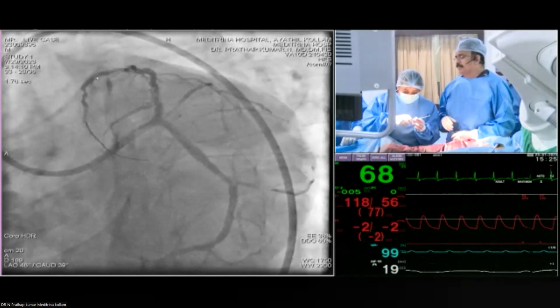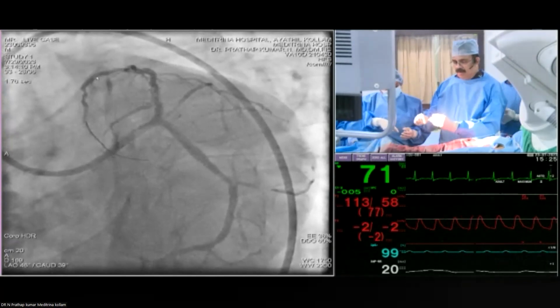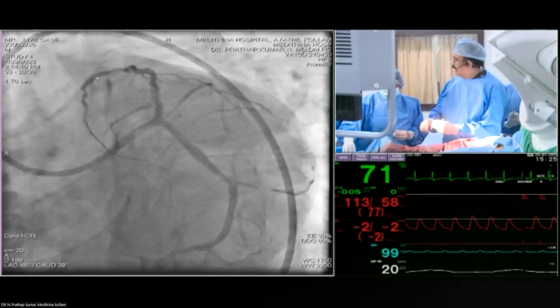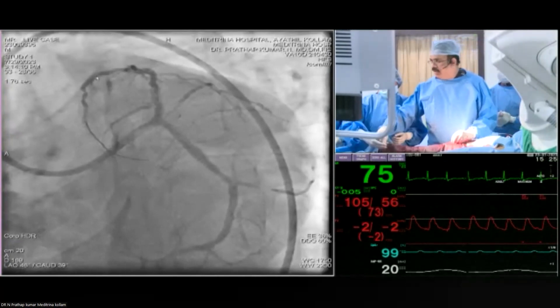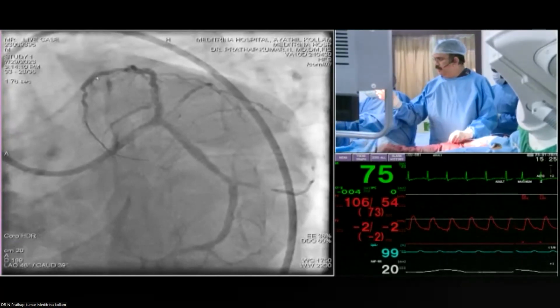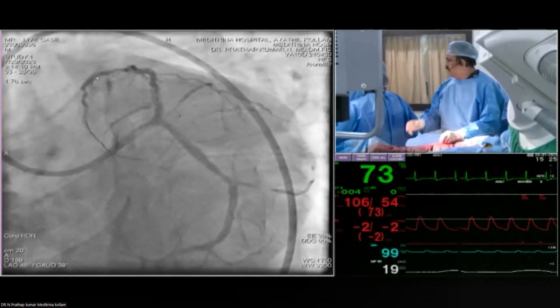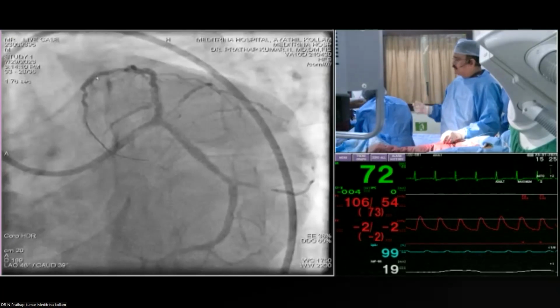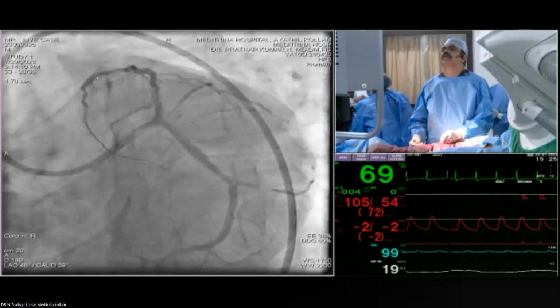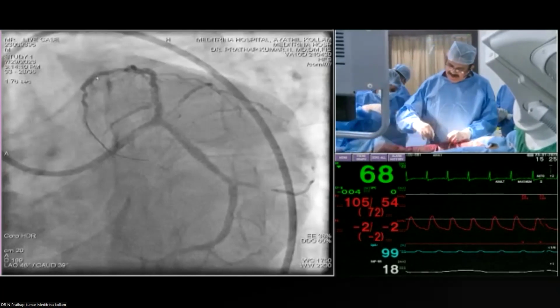Do you like to go by the recommended approach, or is it your modified personal approach? Then you can do a 4 millimeter balloon. Young doctors will be confused. We will actually do a POT and then please recross, go fast. Step by step, like recommended, because if you do your own way, nobody knows what the really classic approach is. Standard. Correct. I will do that.